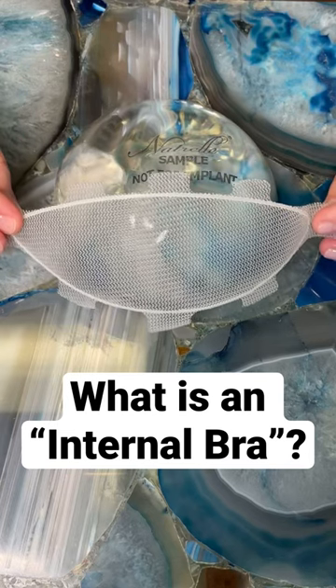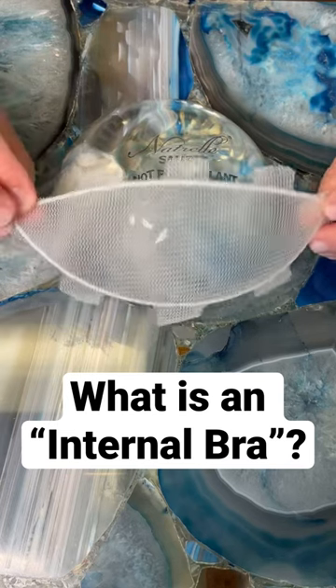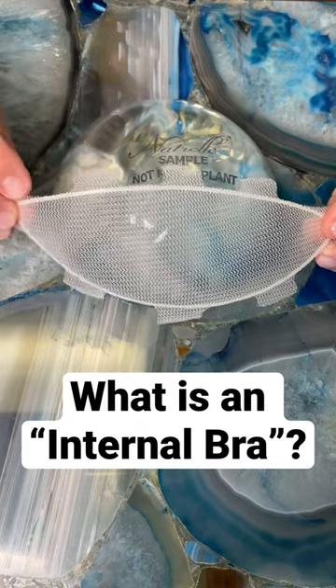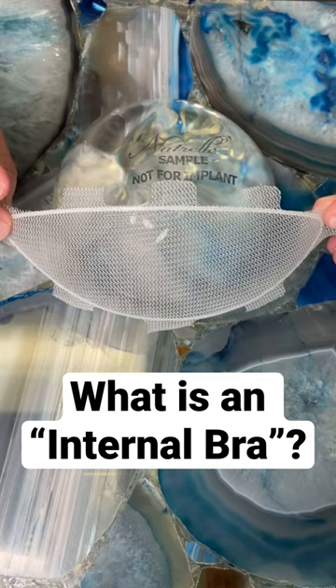Everyone always asks me how the internal bra works. You can see this is the surgical scaffolding. It has tabs for ease of inset and is rimmed to provide shape to the lower pole of the breast.